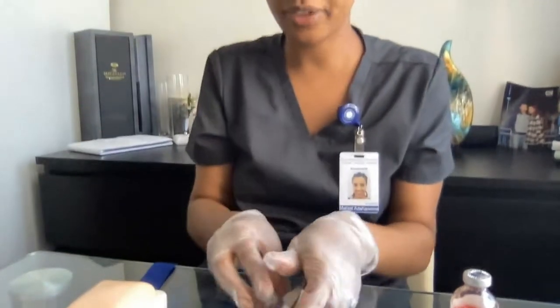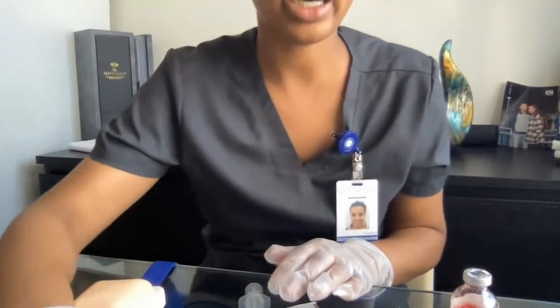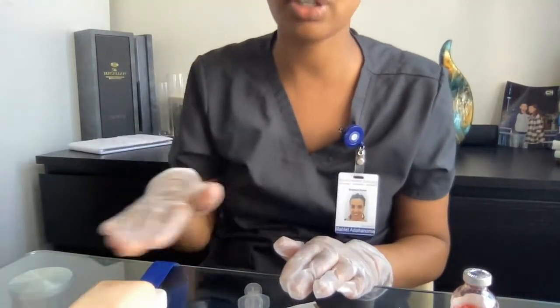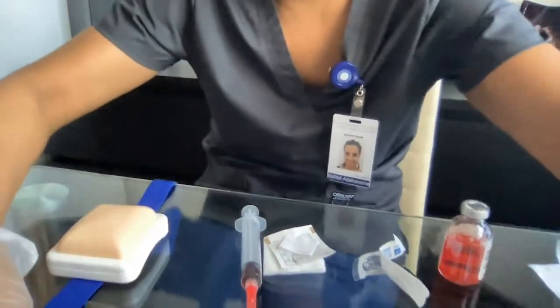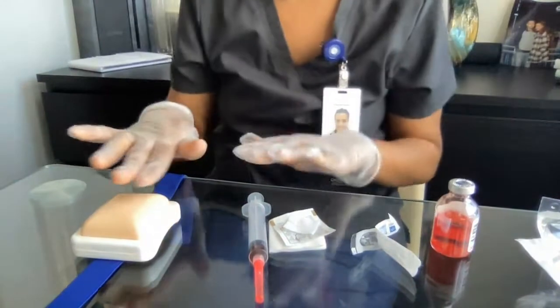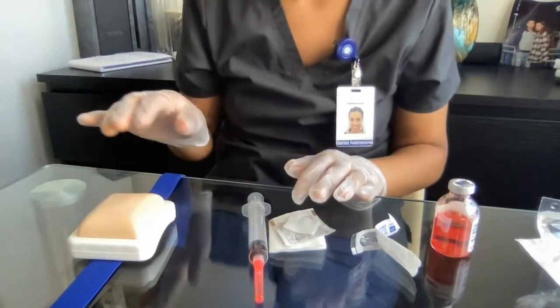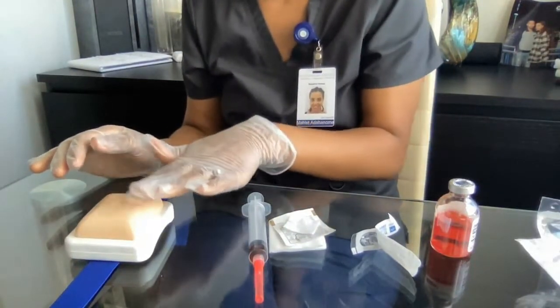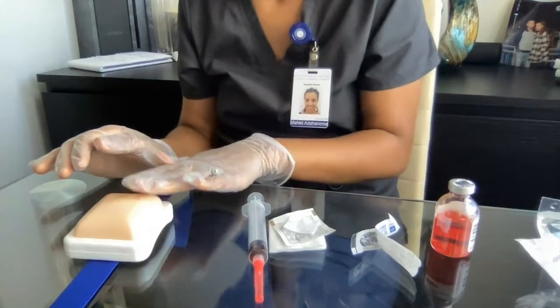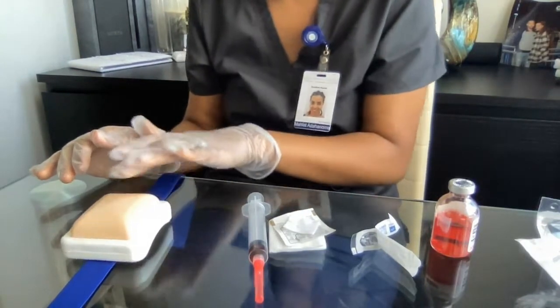The first thing before I inject my medication, I'm going to assess the skin surface for any bruising, inflammation, or edema. If there's none, I can palpate the site to see if there is any tenderness or masses.